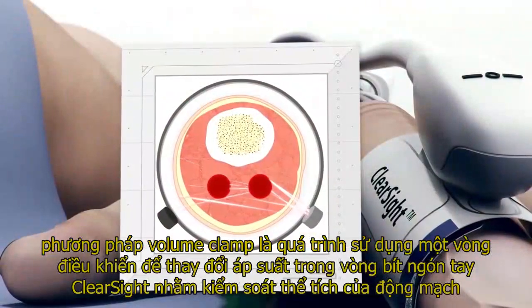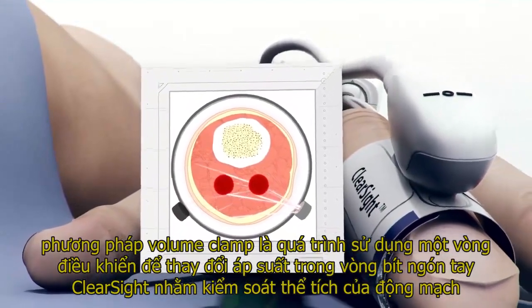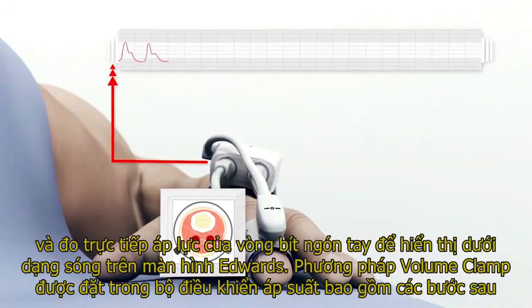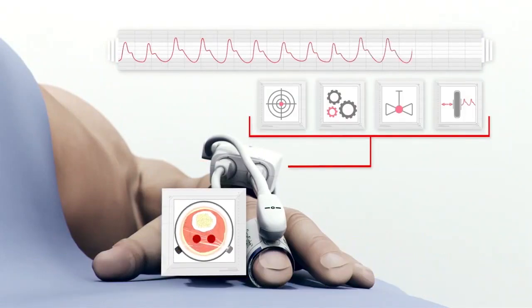The volume clamp method is the process which uses a control loop to change the pressure in the ClearSight finger cuff in order to control the volume of the arteries and directly measure the finger cuff pressure in order to display it as a waveform on the Edwards monitor. The volume clamp method, which is located within the pressure controller, consists of the following steps.